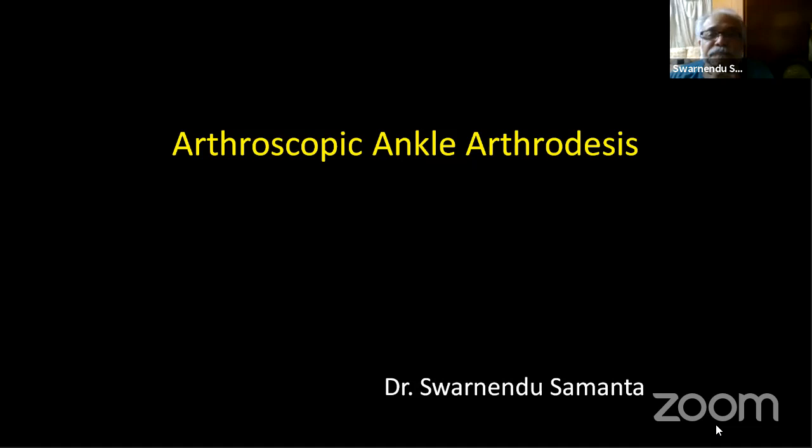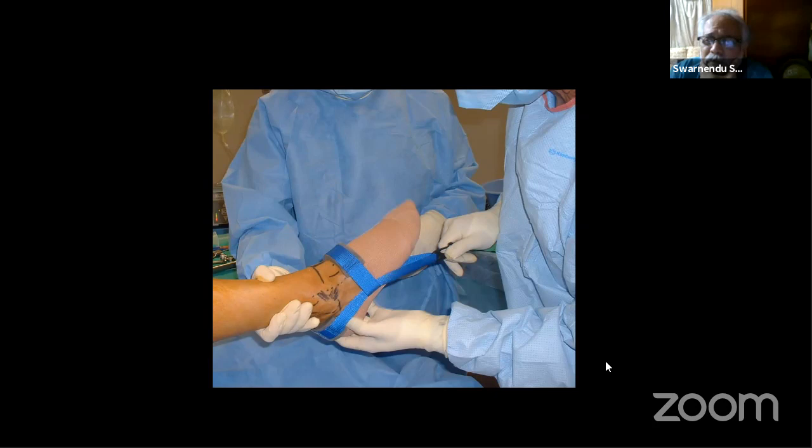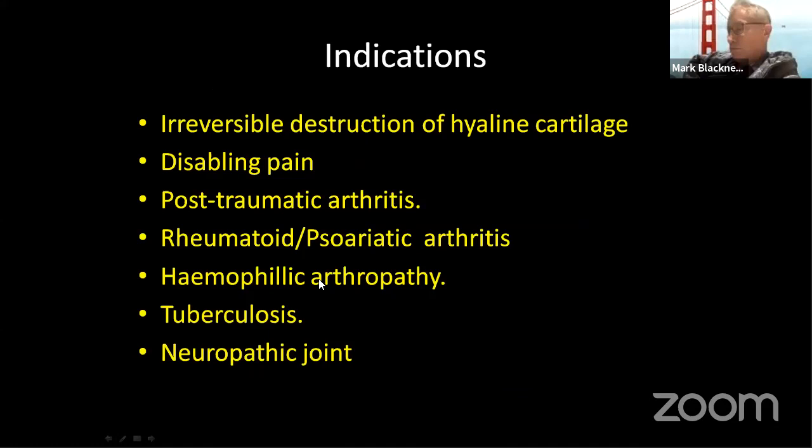So some people are asking how to distract the ankle. Probably nobody on the panel is going to use a fixed distractor or this sort of external fixator. We usually use this sort of distractor. Okay, but even with this sort of distractor, I completely agree with Sundar that you can do your ankle arthroscopy. So before we go there, what are the basic indications of doing your ankle arthrodesis?